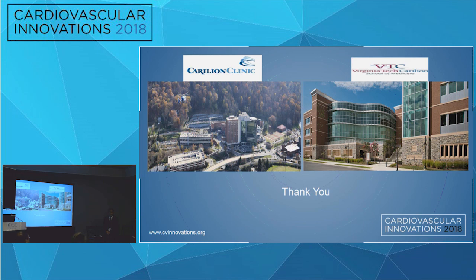I was thinking about some disease in a patient that hemodynamically is not unstable. You have a SCAD on your list. Right. I mean, one could submit that you can just let it go and let the patient be on medical therapy. Yeah, she's in her early 60s, I believe. She did not have any autoimmune diseases, no previous history of coronary or cardiac disease. The right coronary looked pretty bad to me. It was a big vessel. I didn't feel comfortable with that strategy, but that might have been something one could have tried.